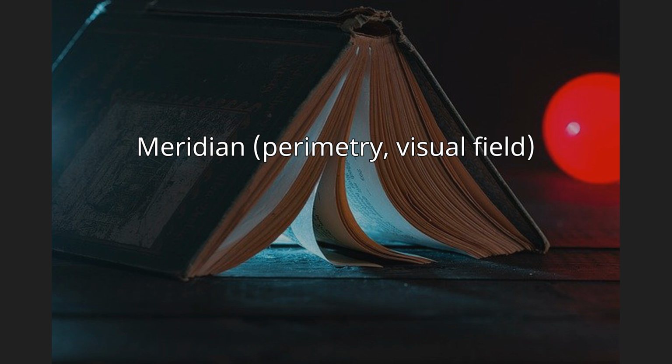If we consider this surface to be that on which an observer can see anything, then it is a section of the sphere somewhat larger than a hemisphere. In reality, it is smaller than this, and irregular because when the observer is looking straight ahead, his or her nose blocks vision of some possible parts of the surface. In perimetric testing, a section of the imaginary sphere is realized as a hemisphere in the center of which is a fixation point. Test stimuli can be displayed on the hemisphere.